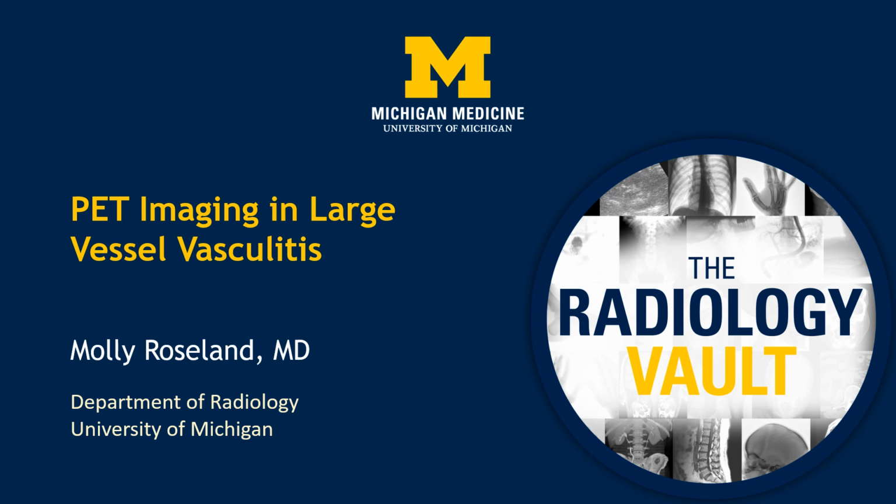Hi, my name is Molly Roseland. I'm a nuclear medicine radiologist at University of Michigan. Today I'm going to be discussing PET imaging in large vessel vasculitis.